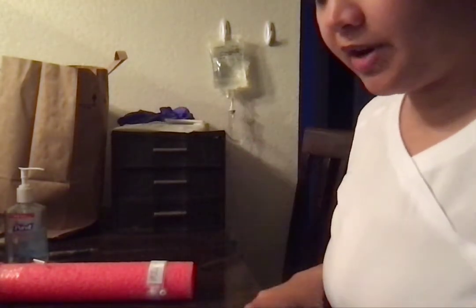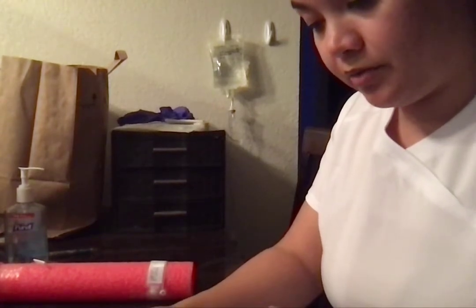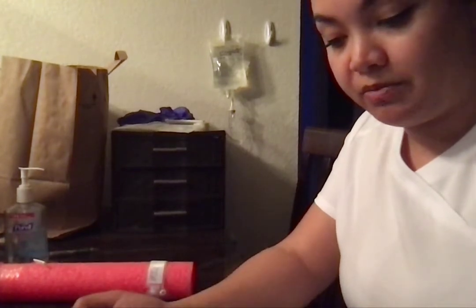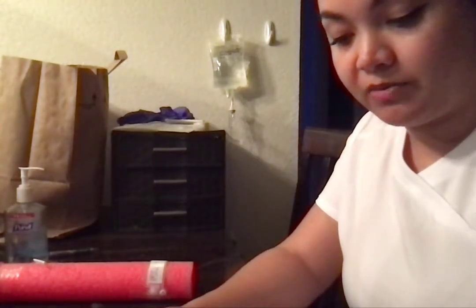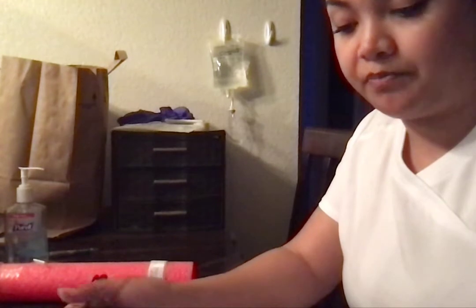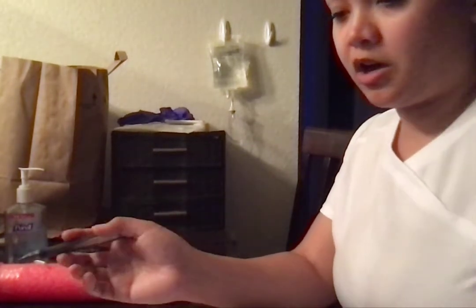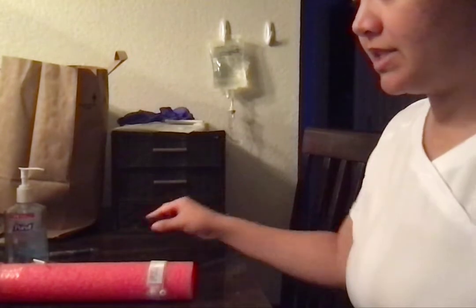Okay, 25 drops per minute. Good. Okay, I have verified that it is the correct time, the correct dose, and ciprofloxacin. Since I'm going to be piggybacking that off of the sodium chloride, they are compatible to run together, so that's all safe there. It's the right situation. All my rights are completed. Okay, so I'm going to go ahead and wash my hands and get my supplies together.